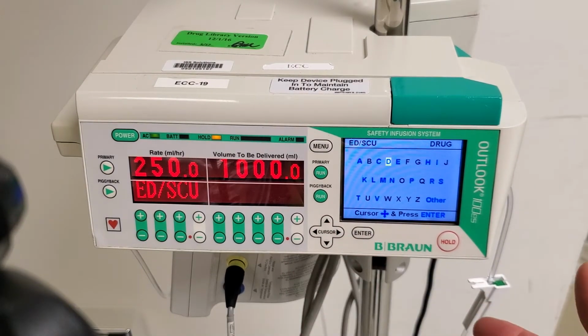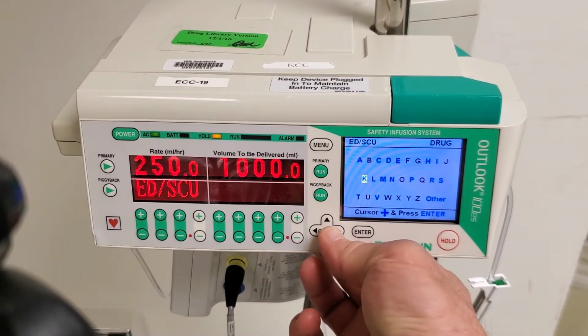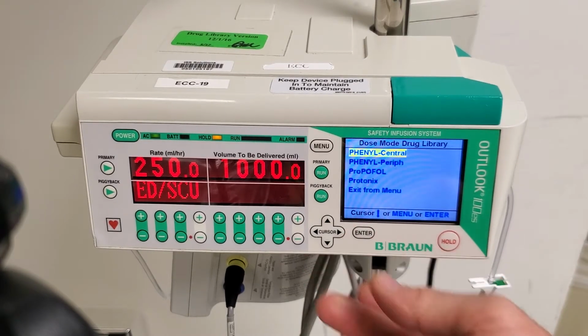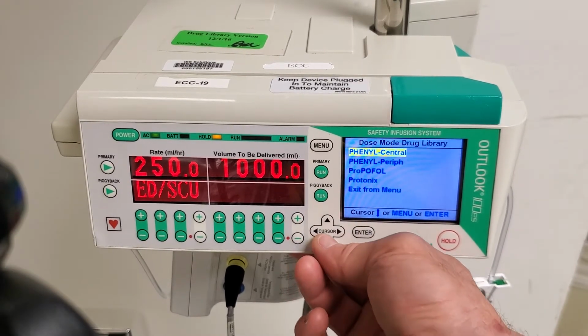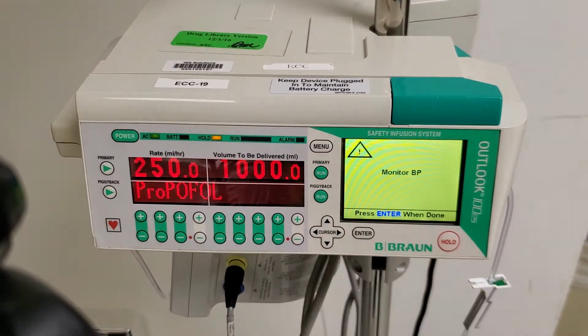All of our common drugs, dopamine, epinephrine, heparin, nitroglycerin, propofol, levofed, are in here. We'll select propofol because it's a weight-based drug. So you move the cursor over to P and you select it with the enter button. Move the cursor down to propofol and select it.